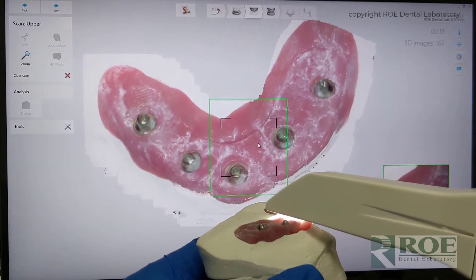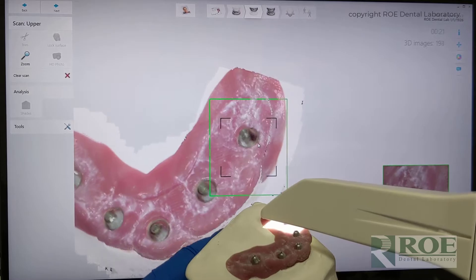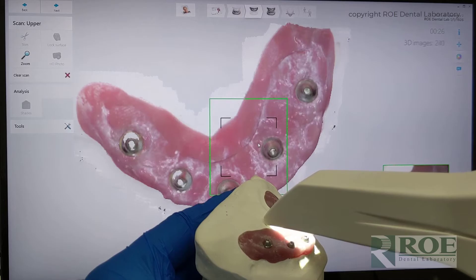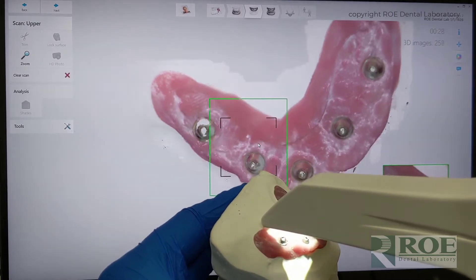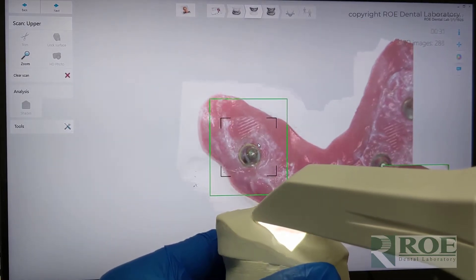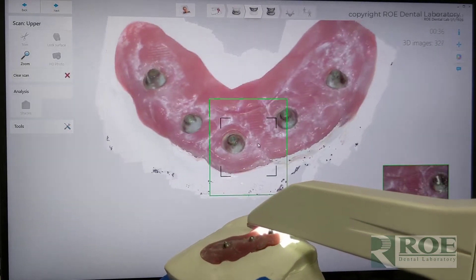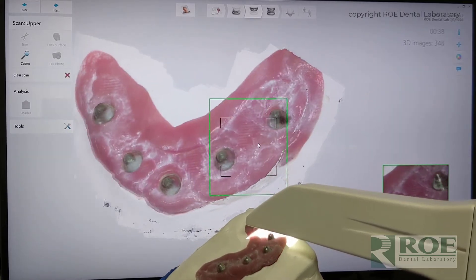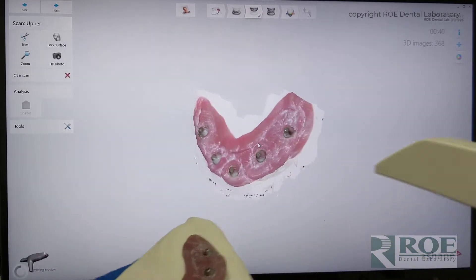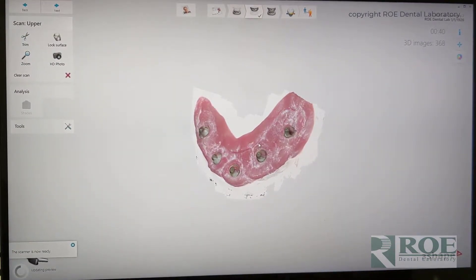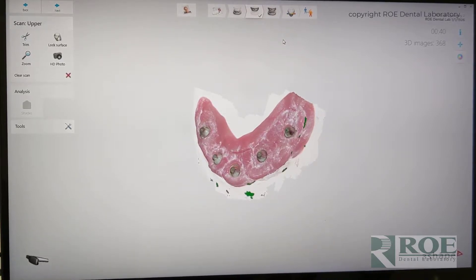Because all we really want to do is be able to register the iJIG scan to the model. I'm just going to go around in a little circle here to make sure we capture the full MUA so that we don't have any voids that we have to guess. That's scan one, that's event one. With this, you would just simply save it, export it as an STL, and upload or send it to us.